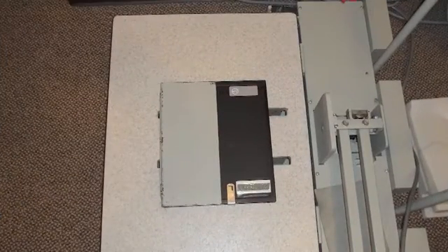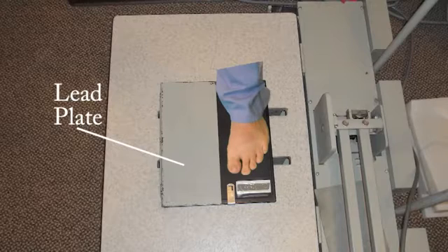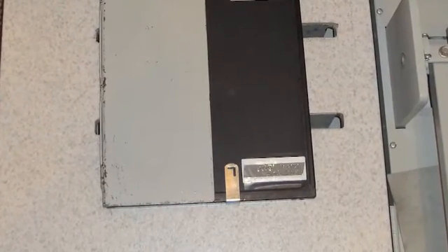When taking the AP, you will need to place a lead plate on the side you want to save for the lateral view, and have the patient place their foot with toes facing you on the part of the film you will be shooting. Although you can place the name and left and right indicator in any place that's visible on the film, one of the easiest places to do it is during the AP view. Place the left-right indicator just above the toe area on the film so that it is visible during the X-ray shot.